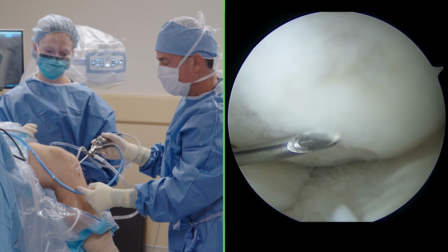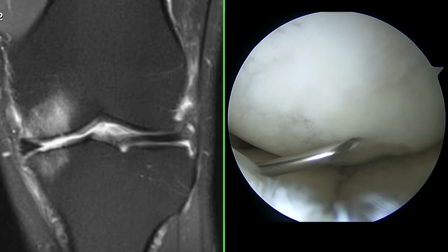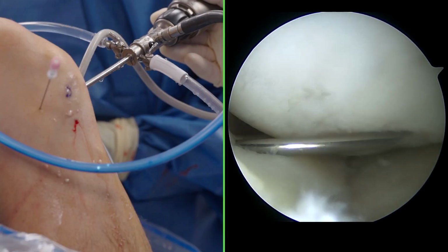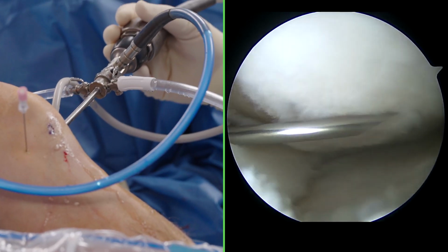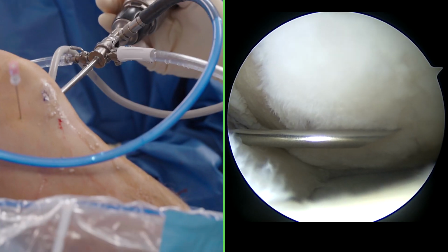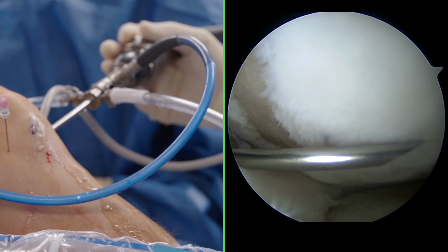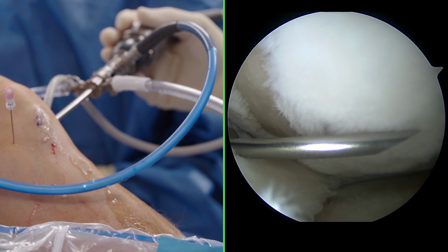So this is the anterior third of the tibia. This is exactly where he would complain of pain, and it also lines up with where the pathology is here in the femur and the tibia. So that's a nice little trick to correlate what you see by MRI with what you're seeing intra-articularly.